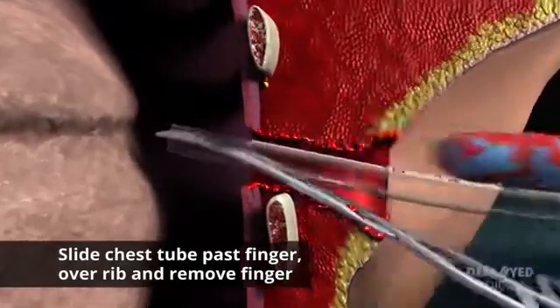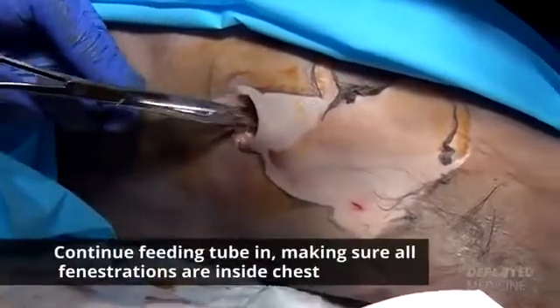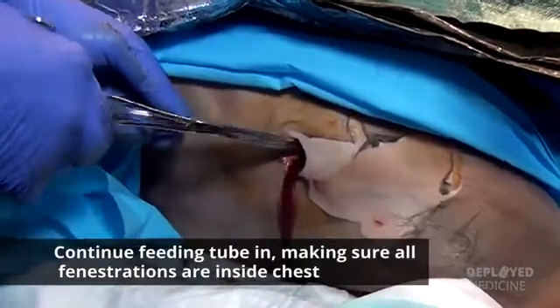I pull my finger out, it's inside the chest. I want to make sure then to continue feeding that in with the pins, making sure that all the fenestrations are inside of the chest.